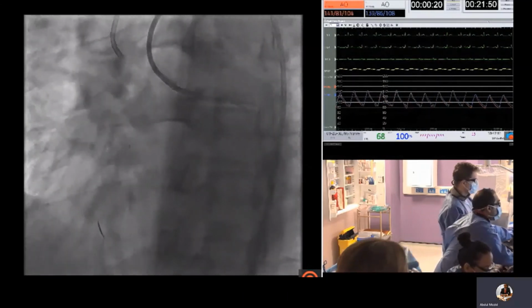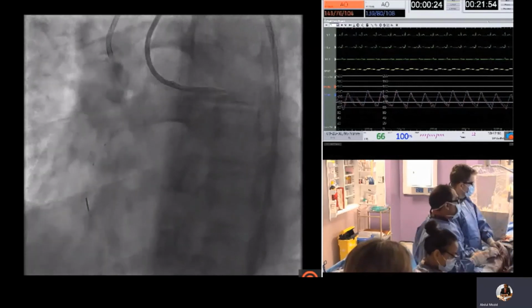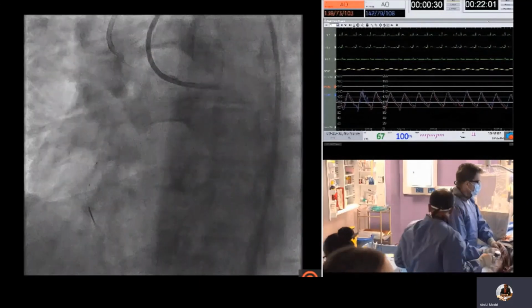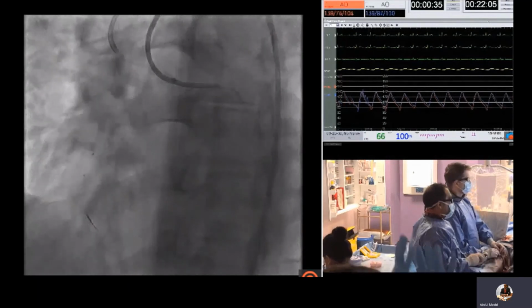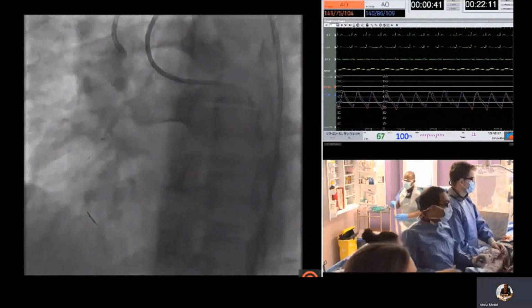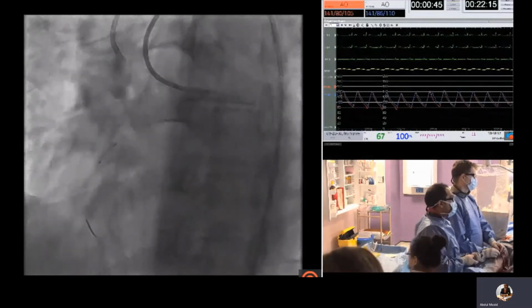So we withdraw the retrograde microcatheter some more. It is important when you're withdrawing the retrograde microcatheter to keep a very close eye on the retrograde guide catheter, which can be sucked in. It's always important to try and have this hanging out into the aorta also over the externalized wire during this process. This is a basic principle of retrograde PCI, but very, very important.